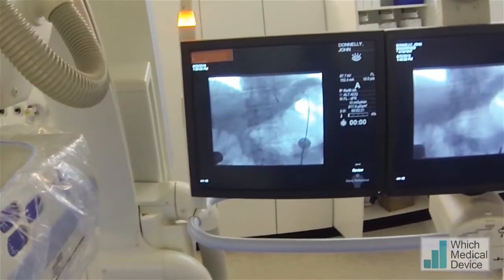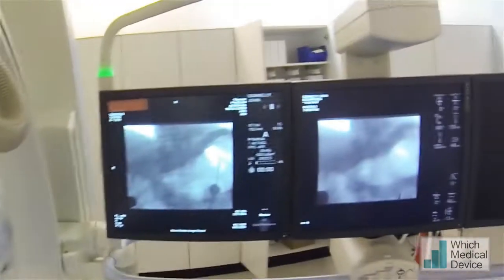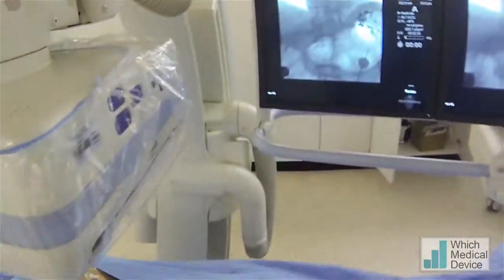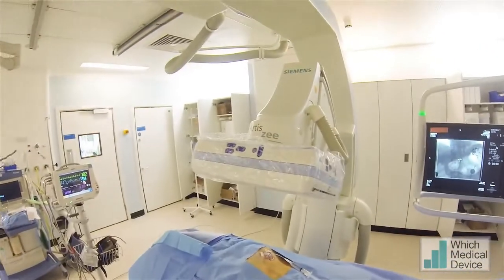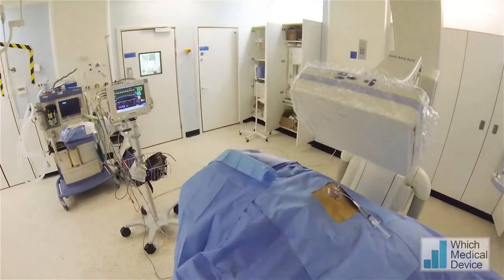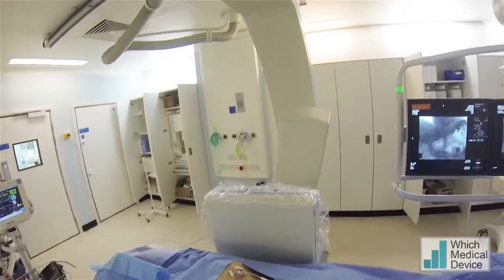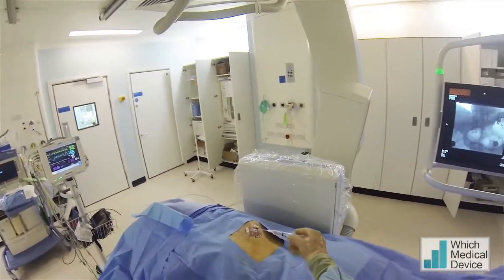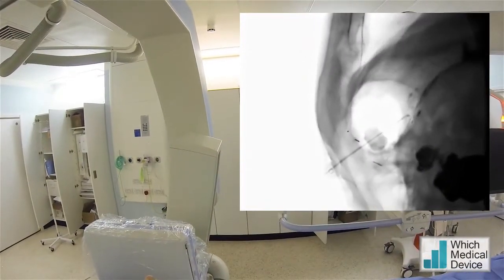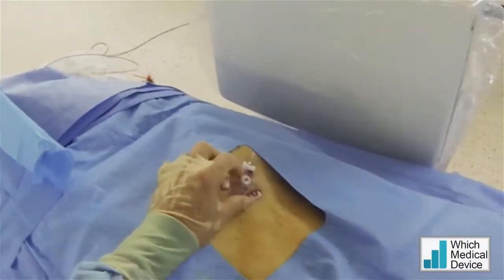Check the position on screening. Just going to take the wire out. Now we're going to use neat contrast to confirm our position within the stomach, and we'll check that laterally as well. Injecting contrast now — you can see that falling away free into the stomach; it's not held up on a flap of mucosa. That's fine, happy with that position. Pop the cap back on the gastrostomy.